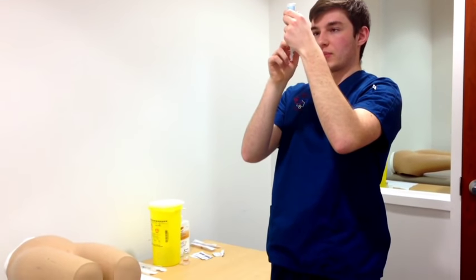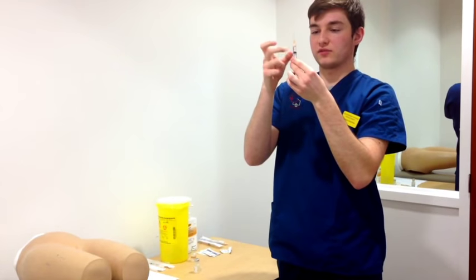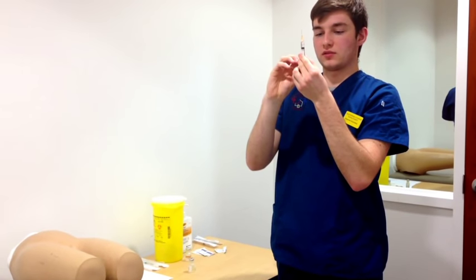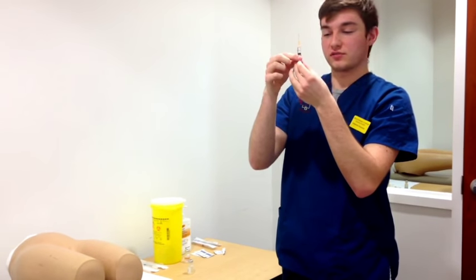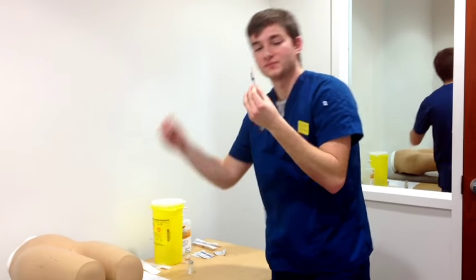Awesome. I will then pull the needle straight out. I do note here there are some bubbles, so I'm just going to flick those away. I'll give a little push with the plunger to release any air and have the appropriate dosage in the syringe. Again, just making sure it's the right amount, 1 milliliter. I can then put the cap back onto the needle.